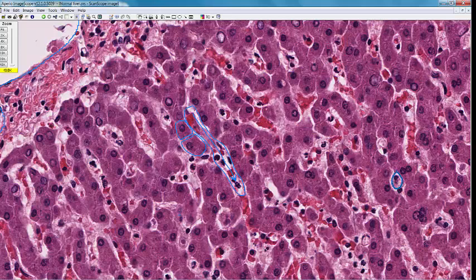In between the hepatocytes are the bile canaliculi. You really can't see them on routine sections, but if you could, there would be one right here. The bile would flow in this direction towards the portal tract. Remember, the liver is a complex, three-dimensional structure, and we are looking at very thin, two-dimensional slices.